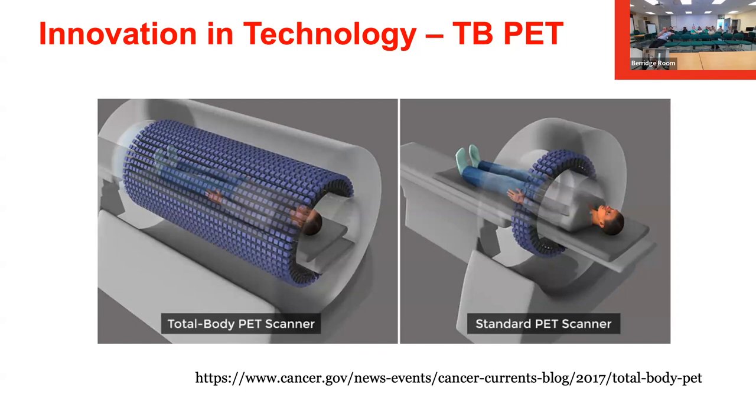For people with PET experience, there was a main revolution in PET scanning when we moved from PET-only scanners to PET-CT, which brought a massive revolution in technology. After that we had some evolution, but not any real revolution, because PET-MRI didn't prove to be revolutionary. It proved to be a good instrument, very valuable for some specific uses, but not enough to be a game changer. Total body PET, we feel, is a possible complete game changer, because it opened up perspectives we were not talking about anymore, and also reopened the discussion about tracers that were no longer used because the technology didn't support them. One discussion is about zirconium, which we had with Gigi, which is very difficult and of very poor image quality. That can be something that we want to use.